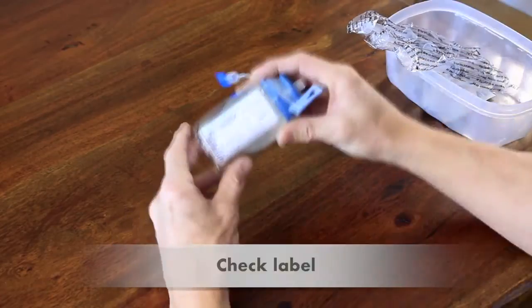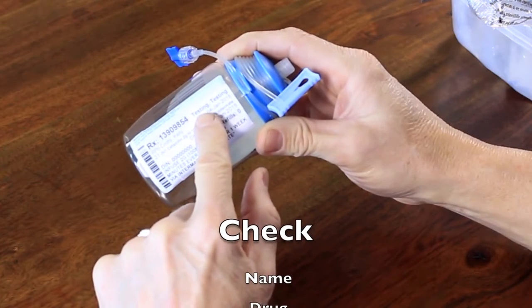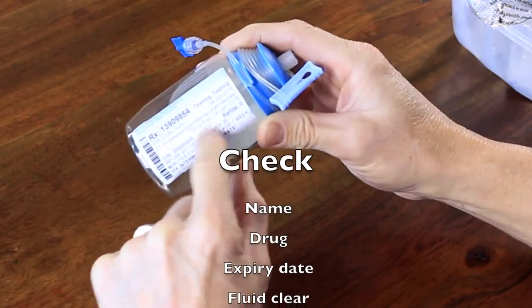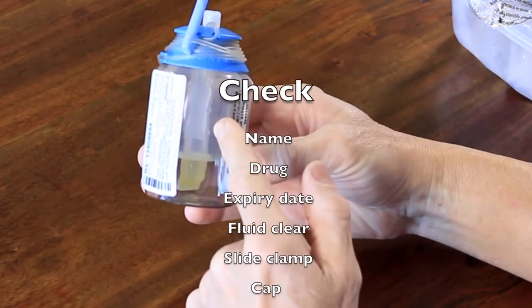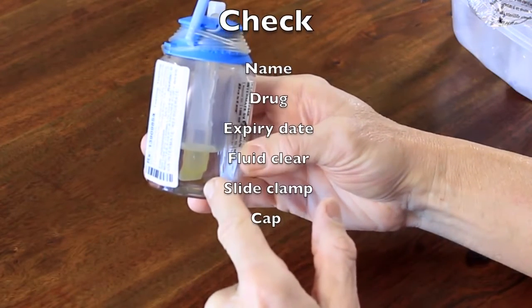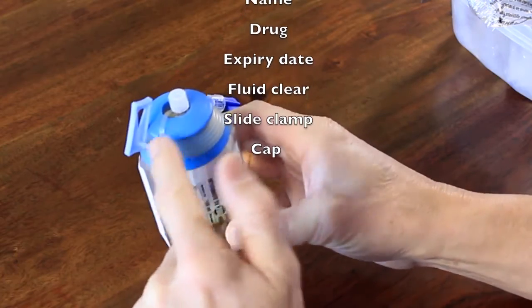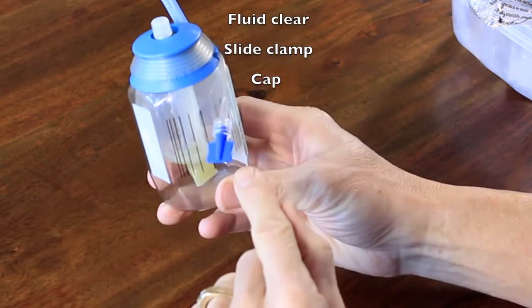Look at the label on your pump. Is it your name? Is it the right drug that you're supposed to get? Is it within the expiry date? Now look at the balloon. Is the fluid clear? Make sure there's nothing floating in the balloon and that there's no liquid sitting in the bottom of the bottle. You need to make sure that you have your slide clamp on your tubing and the cap is on the tubing.